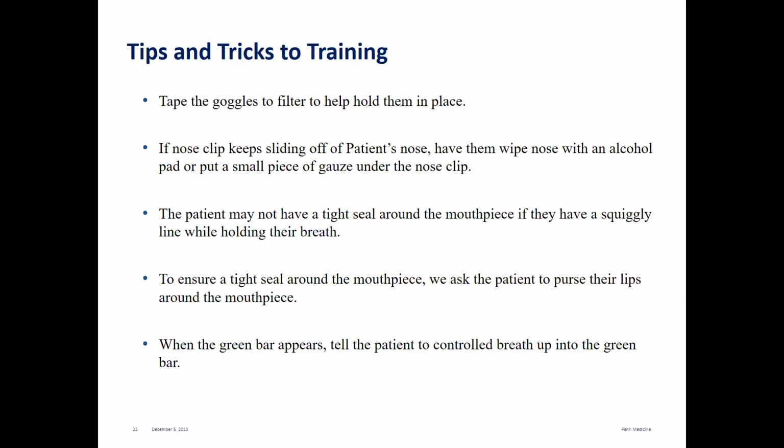Some tips and tricks while training. Sometimes the goggles can slide on their face, or it's at a hard angle for them to be able to see the screen. So you can tape the goggles to the bacteria filter, and this holds them in place better. The nose clip sometimes will slide off a patient's nose. If you take a little alcohol pad to wipe their nose, or put a little piece of gauze between the nose clip and their nose, that also holds it in place. You want to make sure that the nose clip's on really tight so that they aren't able to breathe out of their nose. You want all of their breathing in and out through the mouthpiece and the filter.